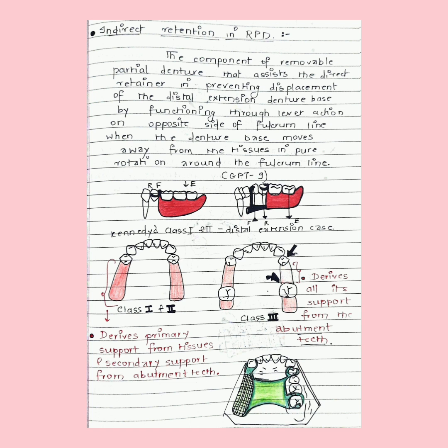The component of a removable partial denture that assists the direct retainer in preventing displacement of the distal extension denture base by functioning through lever action on the opposite side of the fulcrum line, when the denture base moves away from the tissues in pure rotation around the fulcrum line.